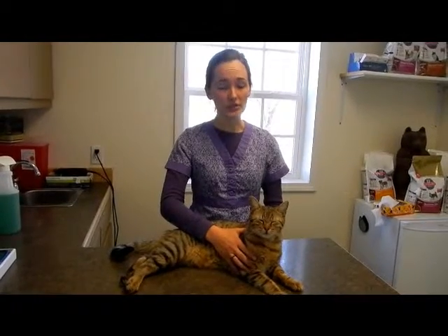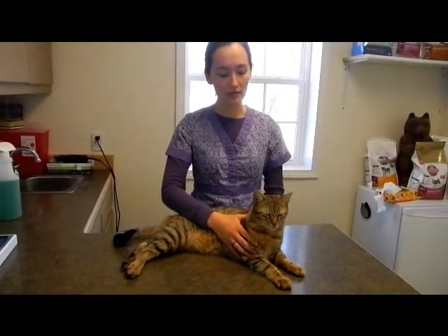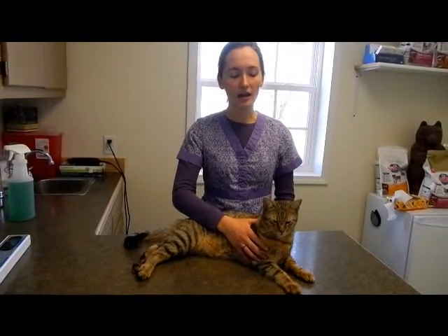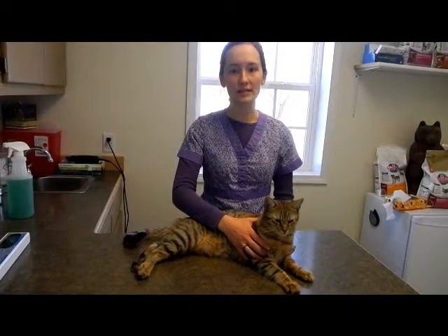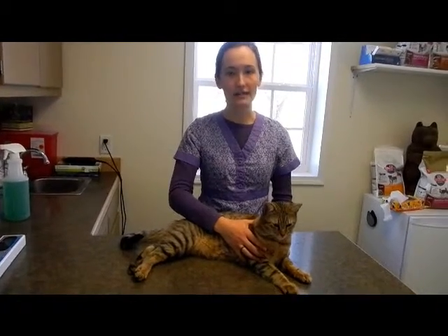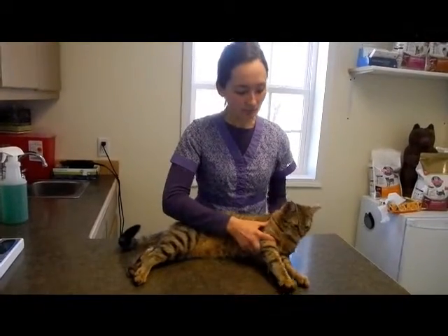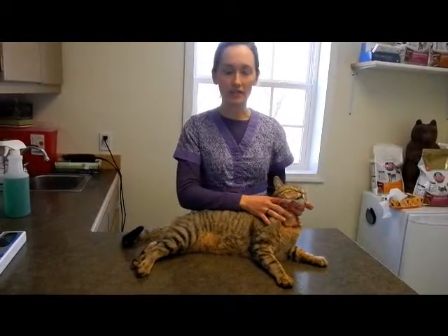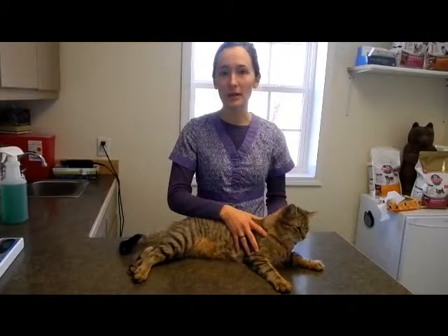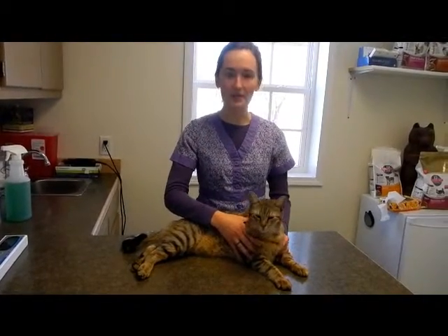The laryngeal or swallow reflex is usually checked when the tube is being passed, because the larynx will contract if that reflex is still present. It will go away at moderate anesthesia. Also, when an animal is recovering from anesthesia, you can watch their throat, and if you can see them swallow, you know that it's okay to take the tube out, because they will take care of any liquid in their mouth by swallowing rather than aspirating it into the lungs.